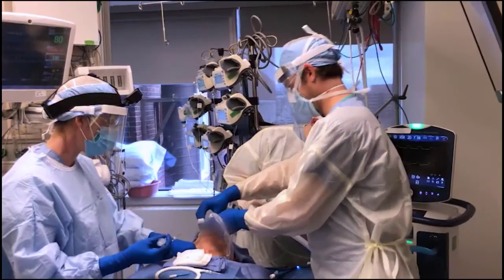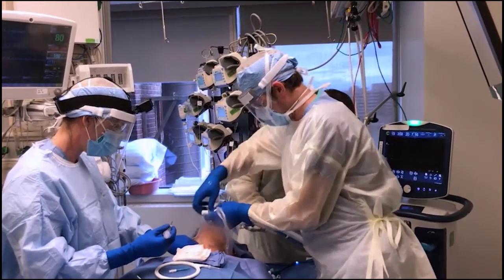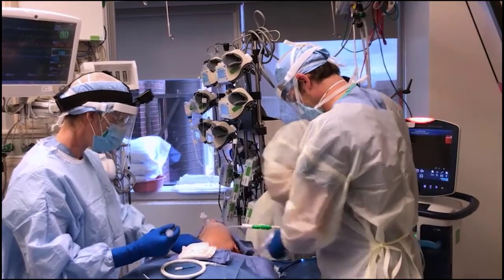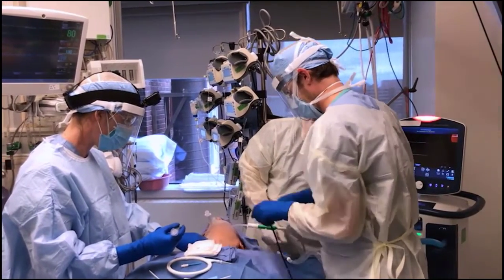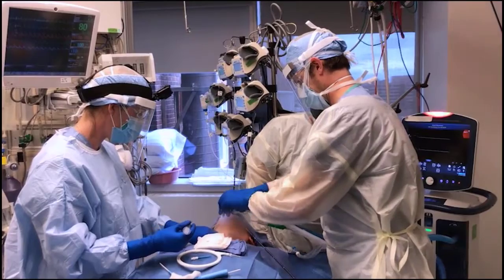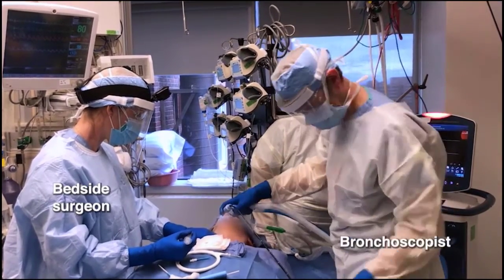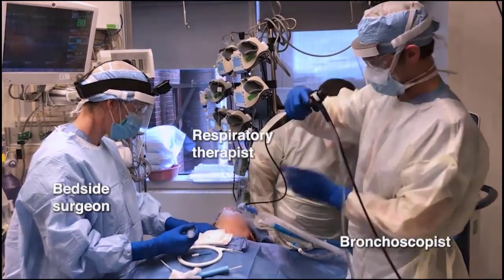Minimizing the exposure of healthcare personnel to aerosol-generating procedures is critical when treating patients with COVID-19. To safely perform percutaneous tracheostomy, a minimum of three people must be present: the bedside surgeon, a bronchoscopist, and a respiratory therapist.